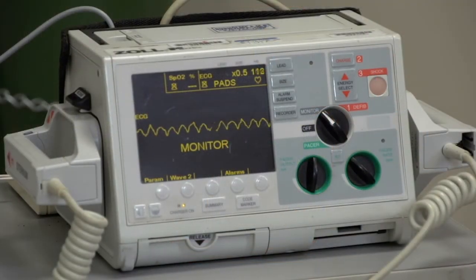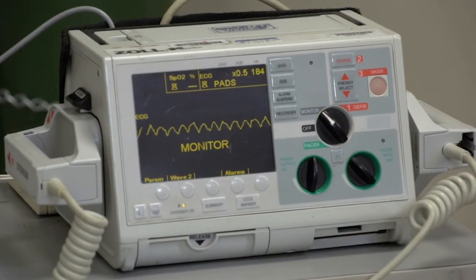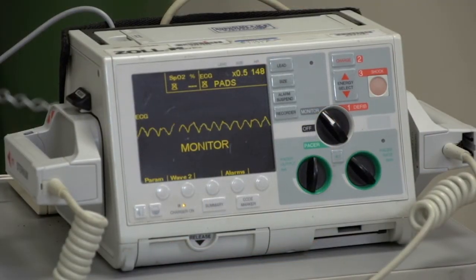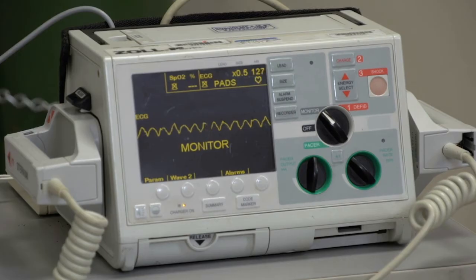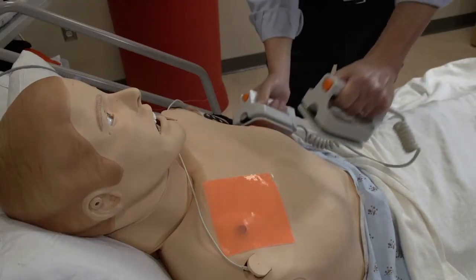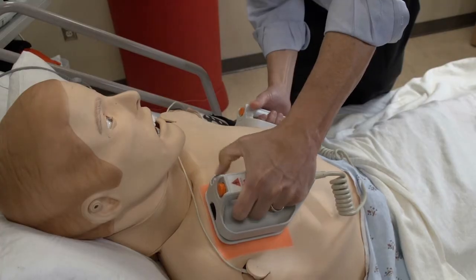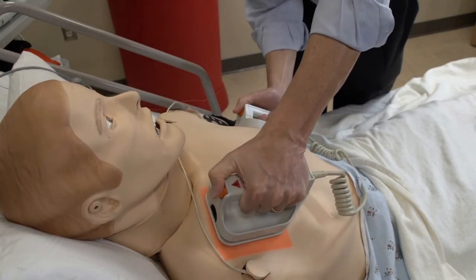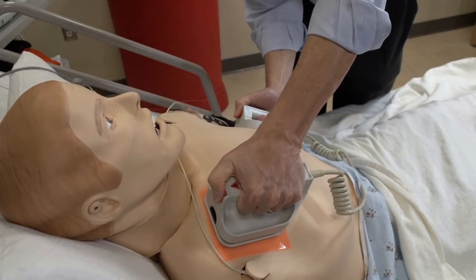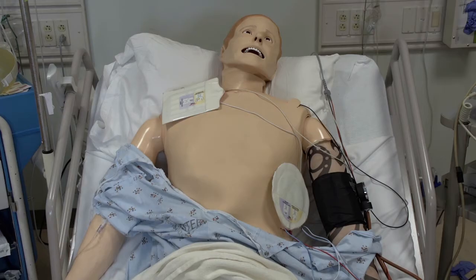With a manual cardioverter defibrillator, the user must recognize shockable rhythms, set current levels, and decide when to defibrillate. These machines usually have paddles that are held against the chest to monitor rhythm and deliver a shock. Sometimes the paddles can be replaced by adhesive electrode pads.